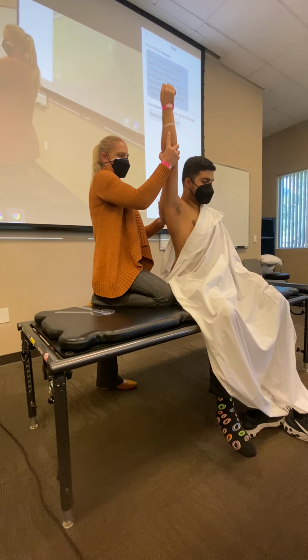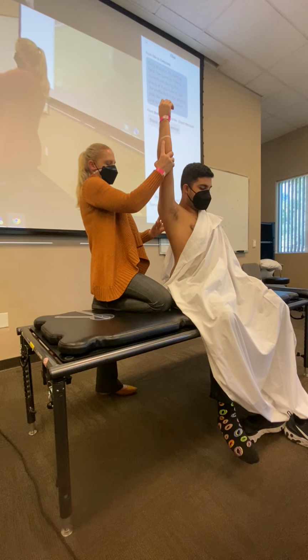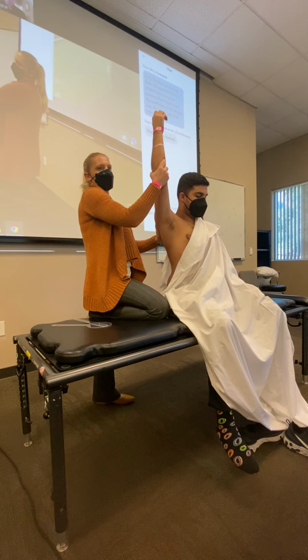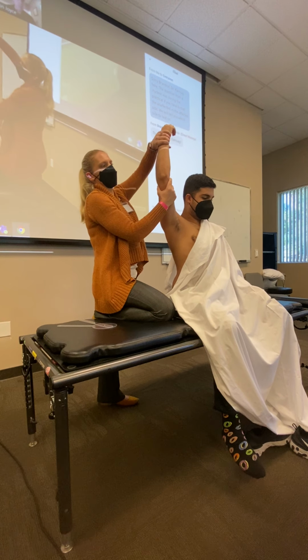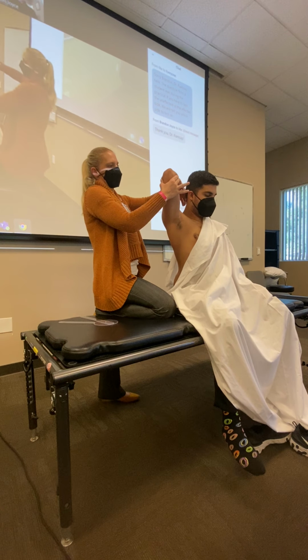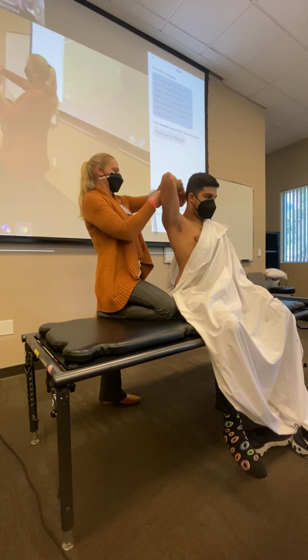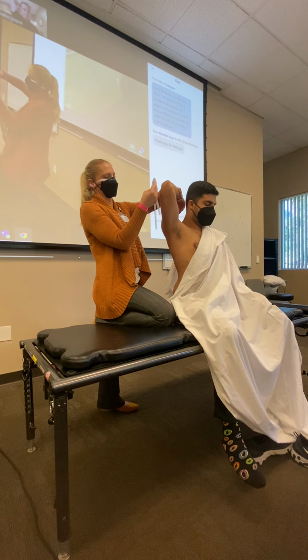Any pain? You feeling okay there? Remember to breathe. And then once we're in that full shoulder flexion, I'm probably stabilizing a little bit more here, just to make sure he's not arching his back or doing something weird, stabilizing at the elbow to make sure he maintains that supination and external rotation. And then from here, holding that humerus, I'm going to gently bring his elbow into flexion until I feel that muscle resistance. And then you're going to measure the elbow flexion. So lateral epicondyle, towards the acromion, towards your radial styloid process is your fulcrum, stabilizing arm, and moving arm.